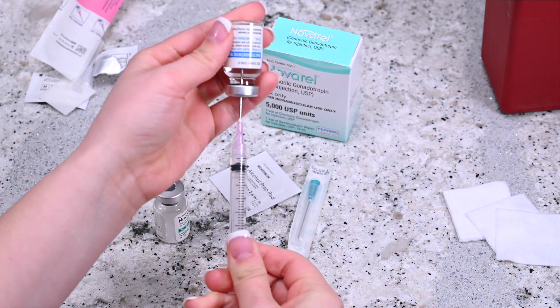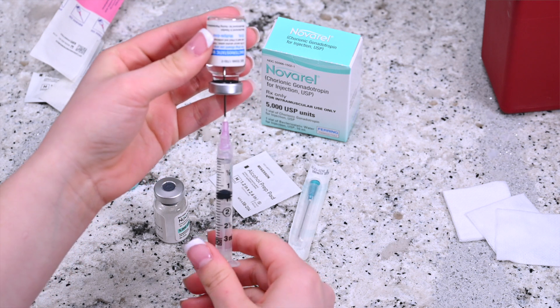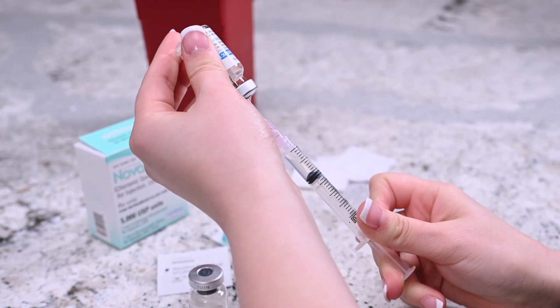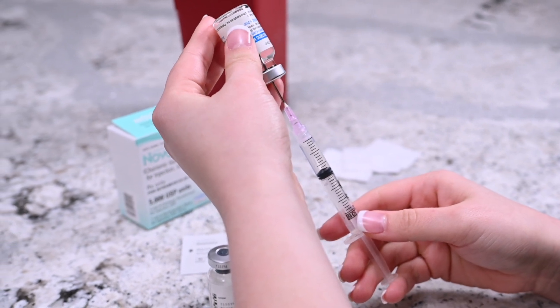Invert the syringe so that the vial is upside down but still attached to the syringe. Make sure that the medication submerges the tip of the needle. Pull back on the plunger of the syringe and measure the proper dosage. Keep the tip of the needle immersed in the solvent by moving the needle down as you draw the medication.